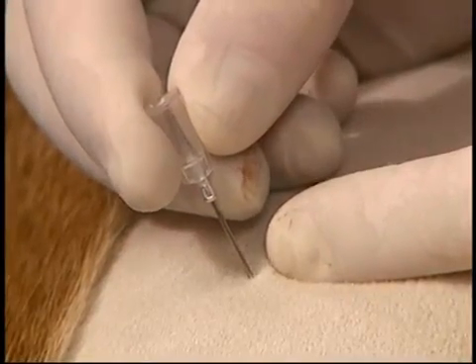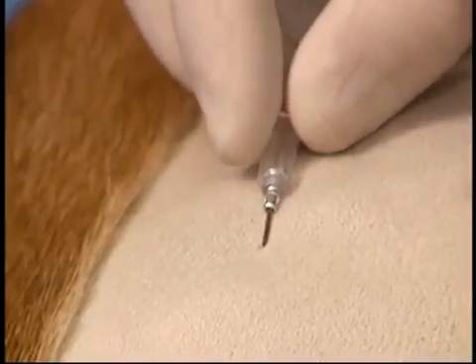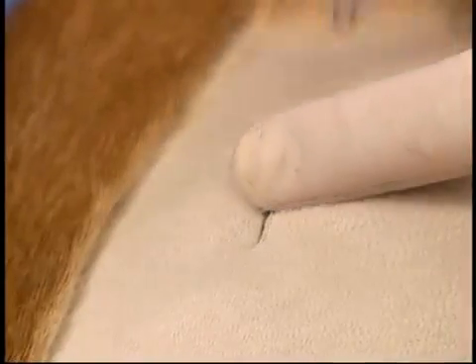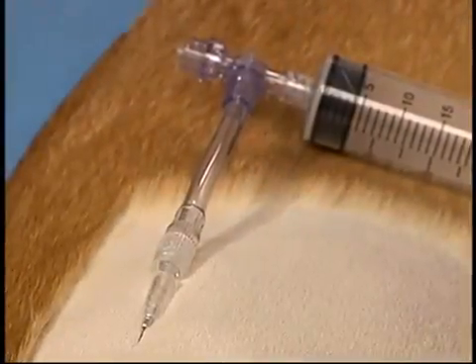Once the needle has penetrated into the pleural space, it's advanced another two or three millimetres, and then tilted laterally to ensure that the bevel is outwards, so the needle will not insert into the lung as fluid and air is aspirated.